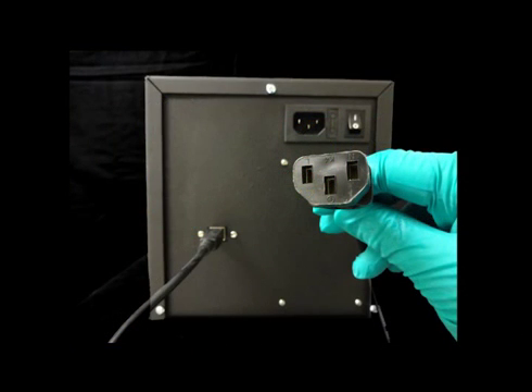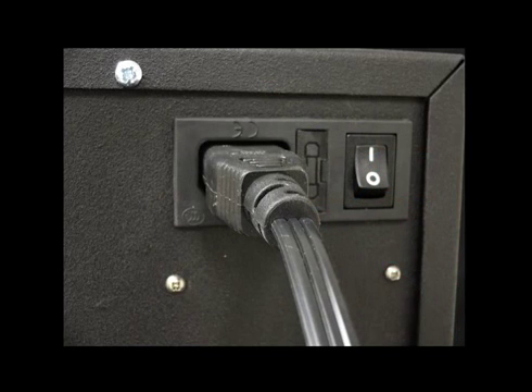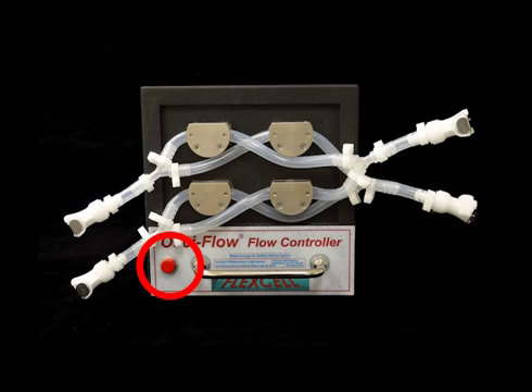Next, connect the power cable that was packaged with the Ossiflow to the outlet on the rear of the Ossiflow device. The opposite end of the cable connects to the power outlet. Use the flip switch on the rear of the Ossiflow to turn the device on. The red light on the front of the device will illuminate when powered on.